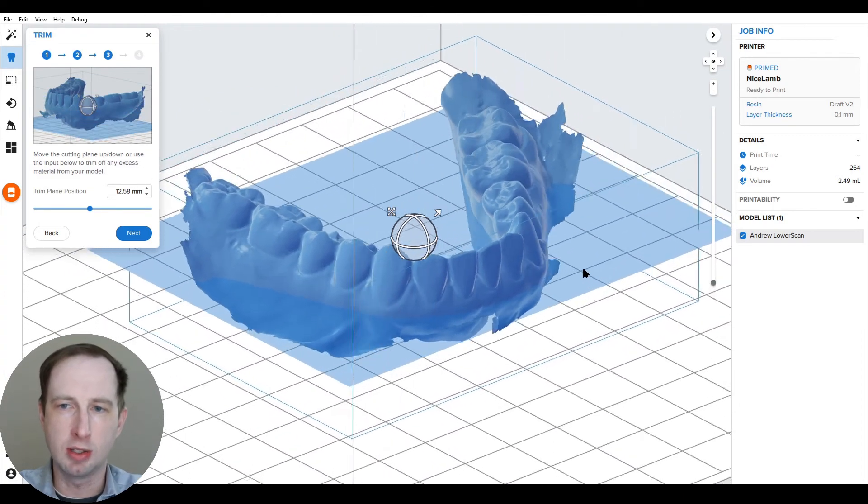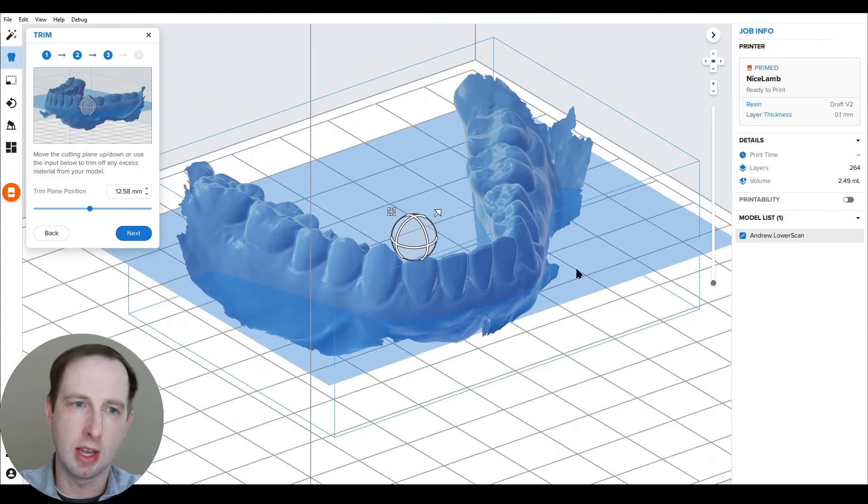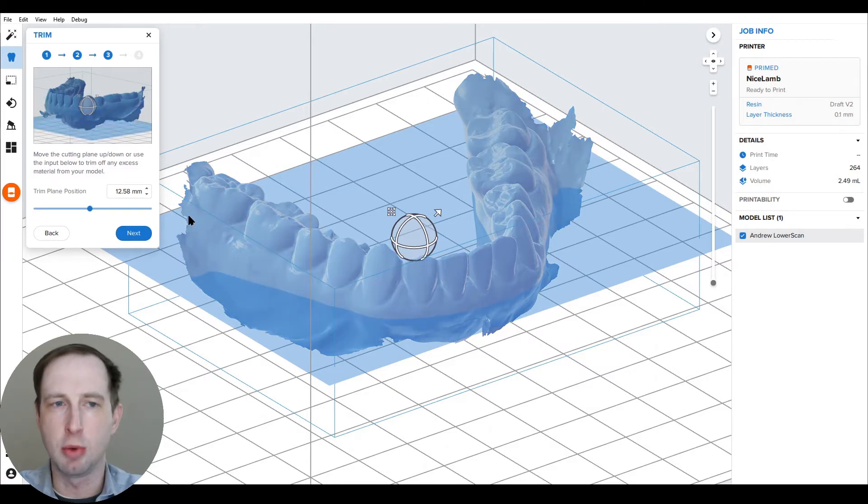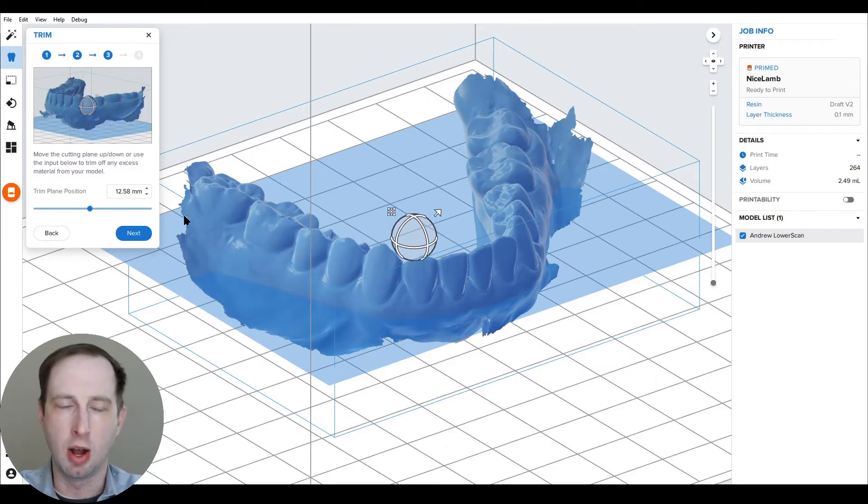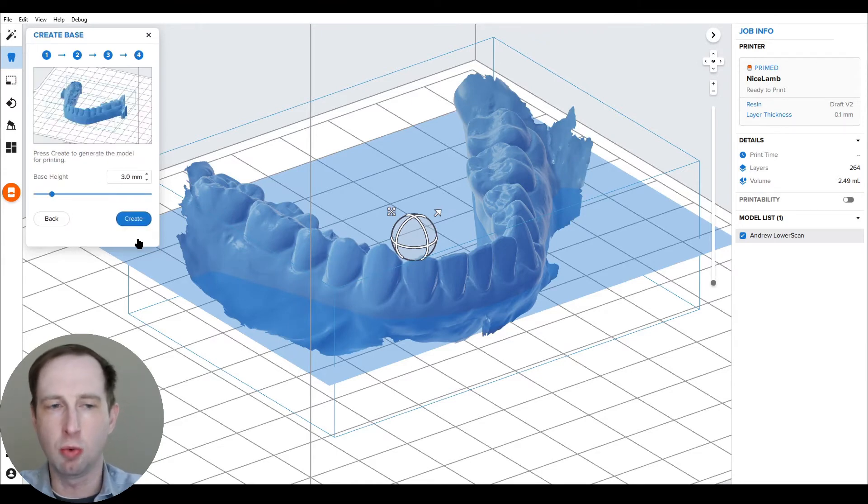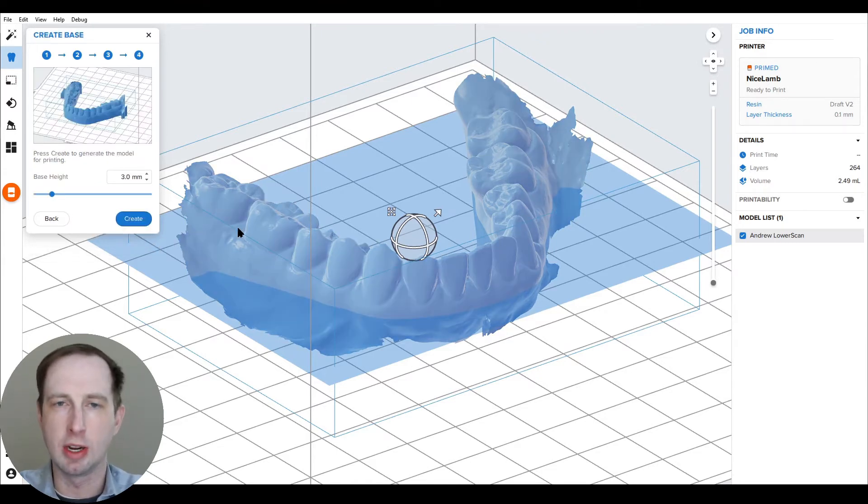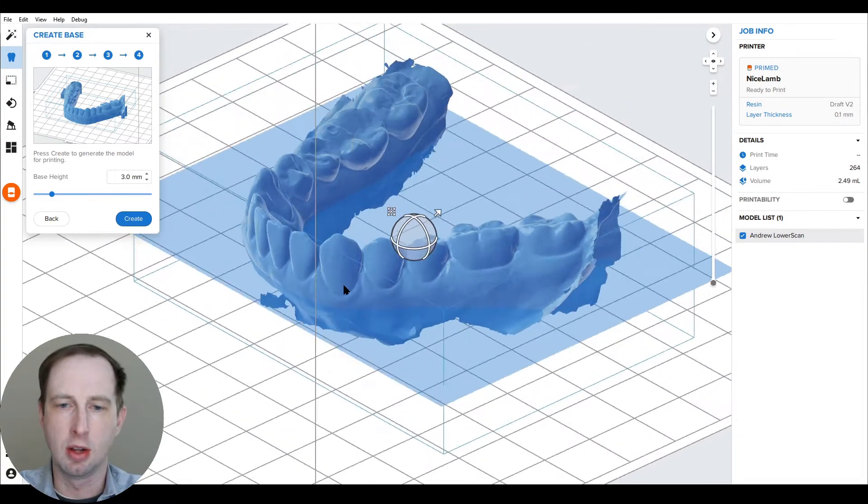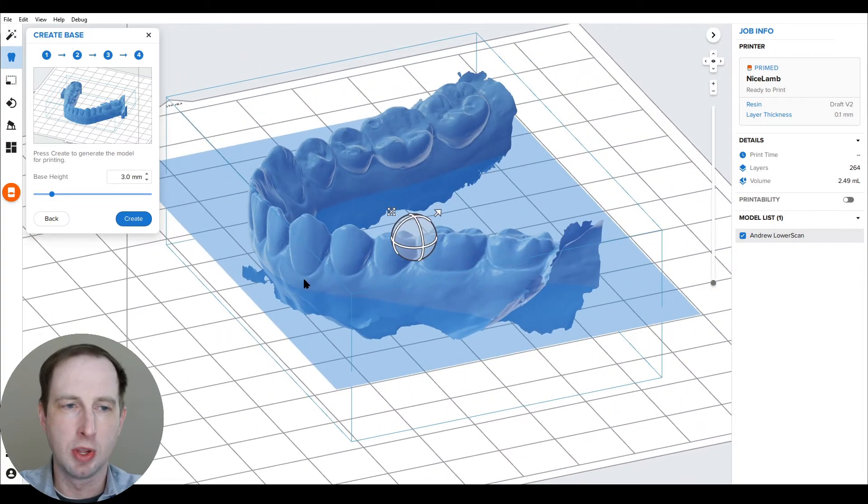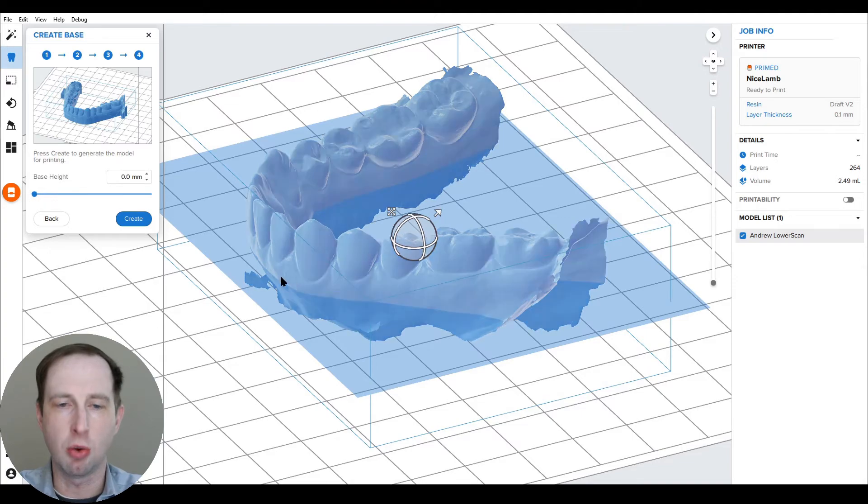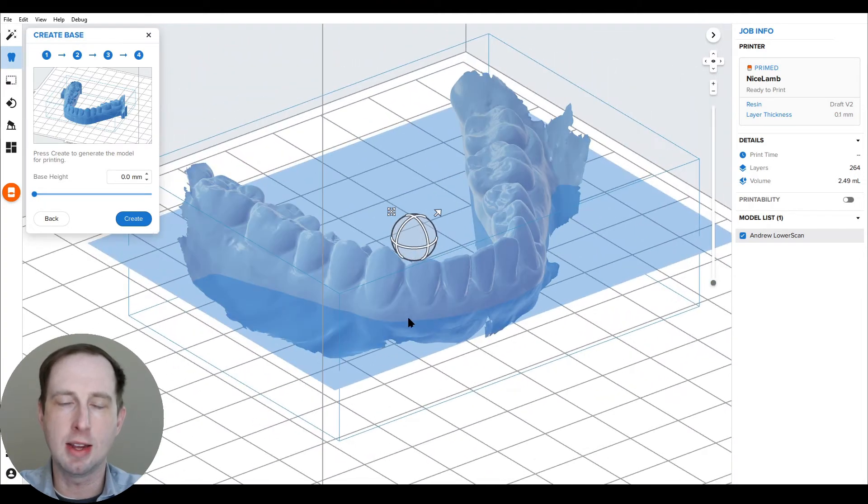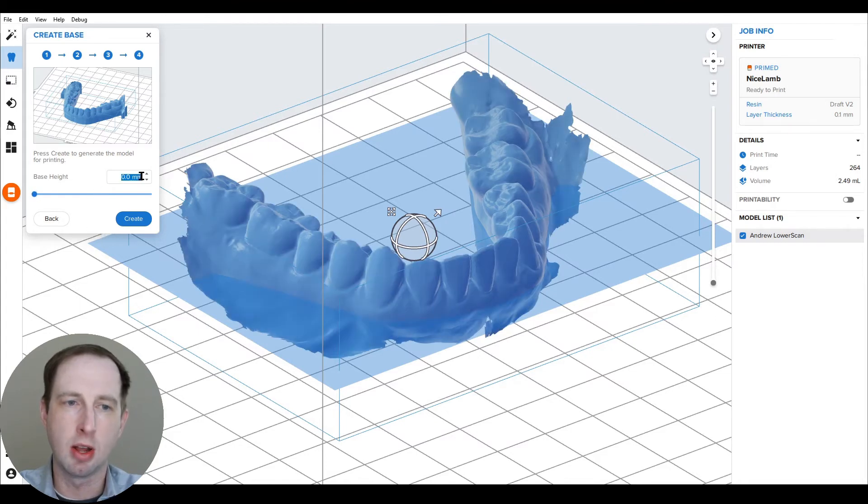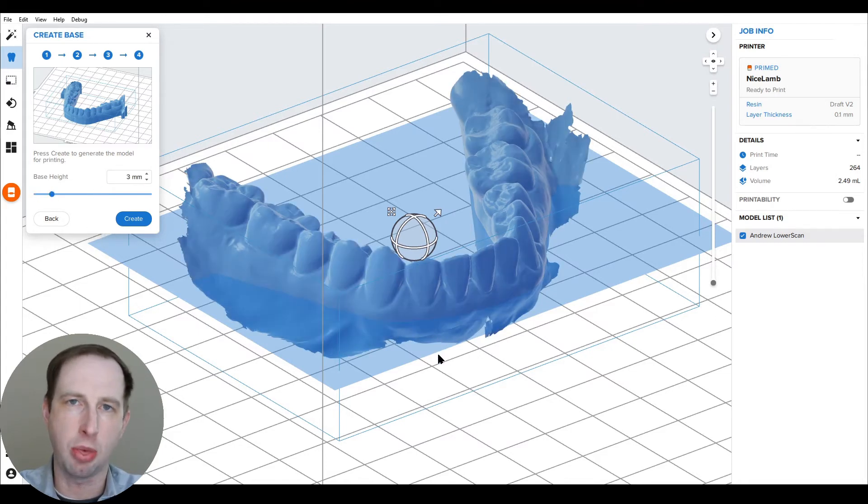If you wanted to keep all the scan data, you can leave this in the leftmost position or a zero value for the position, and it will just keep all the scan data. Trimming it will make a better looking base overall because it's a nice clean cut. Next is the base height. This is applying additional base thickness from the plane cut. If you type in three here, this is going to be from the plane cut down three more millimeters of model.